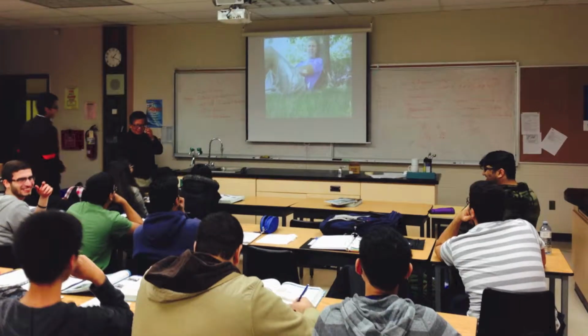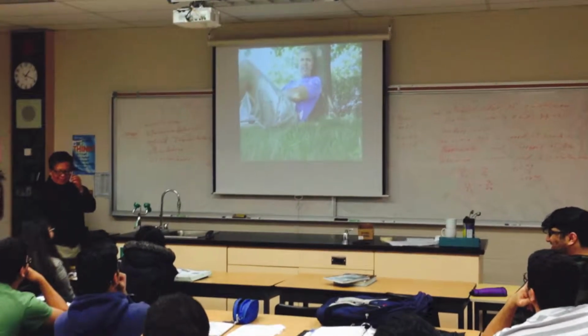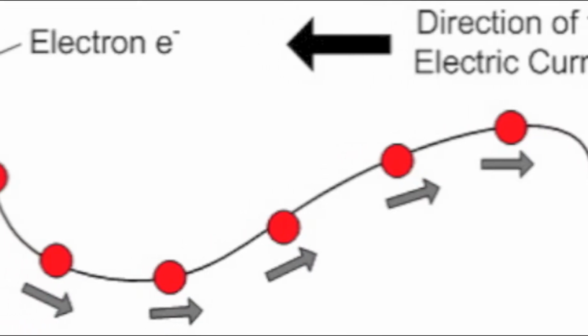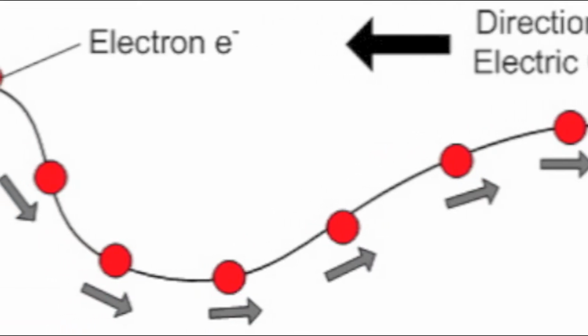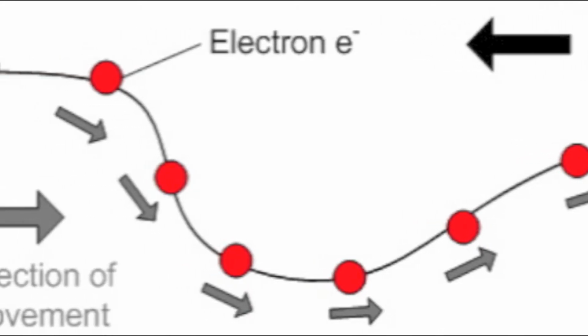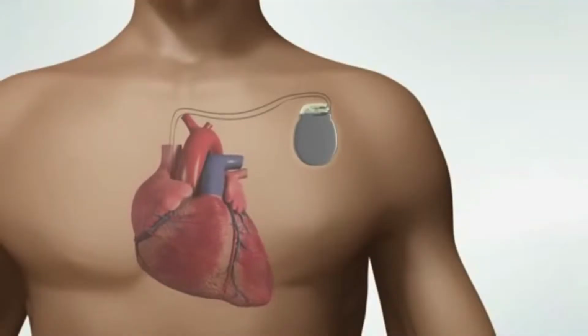can't do its job. Whether or not I was in that class that day, I'm pretty sure Mr. LeBreton discussed electrical current and its properties. In the article, Pacemakers for Anesthesiologists Made Incredibly Simple, Dr. Arthur Wallace states, in some aspect, the functionality of the pacemaker is of a drug delivery device. An electrical current is the flow of electrons and the drug delivered are electrons. So the current is the dose of electrons per second.